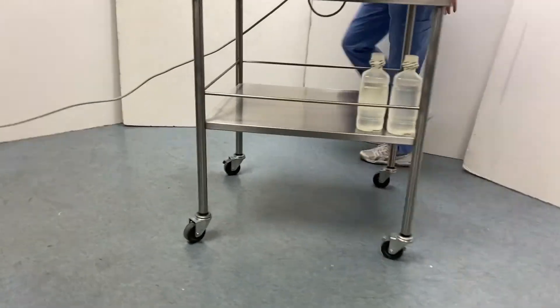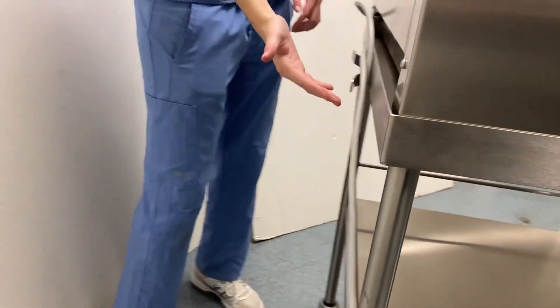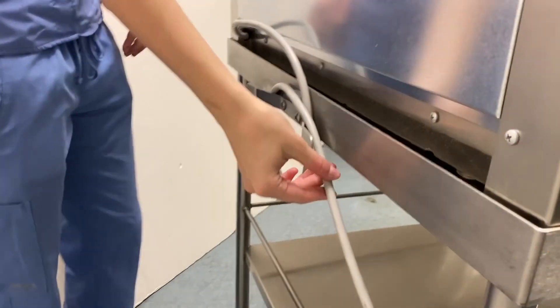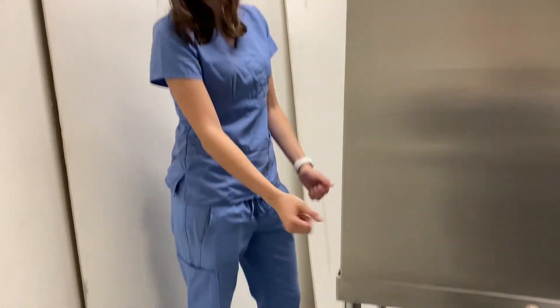If you come around to the back, you'll see that there's a cleat so that you can wrap the medical grade cord around for either transport or, as you can see what we've done here, just to shorten the cord a little bit.